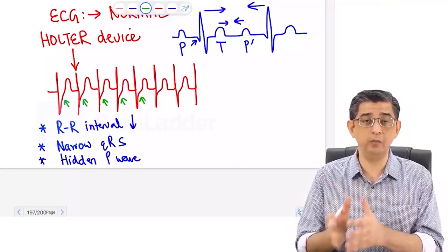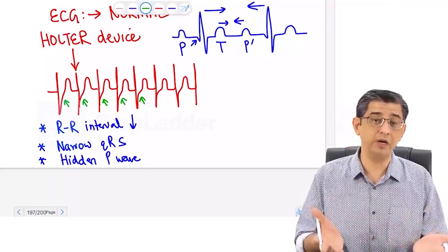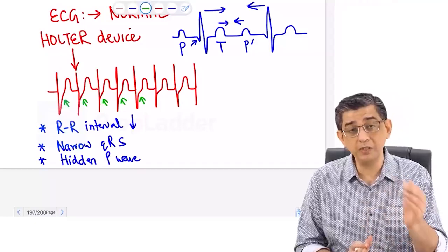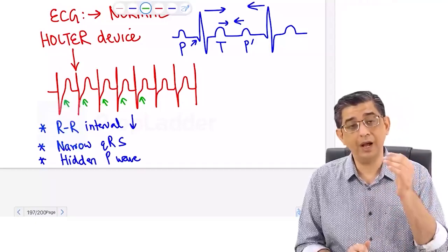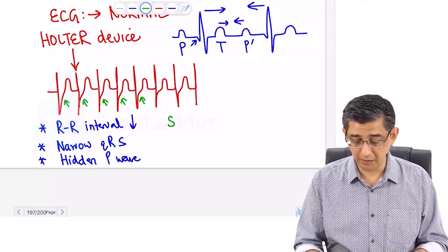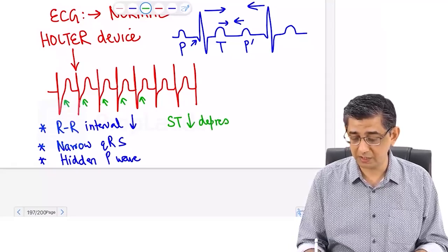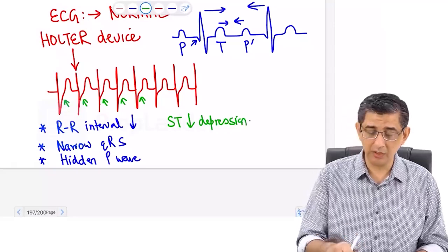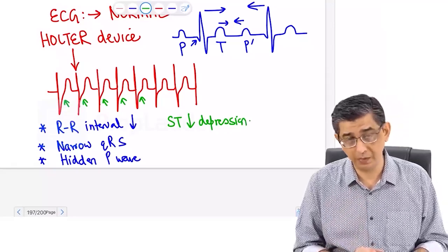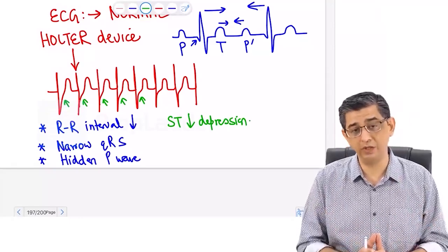I mean, there's a limited amount of oxygen available via the patent coronary arteries of the patient, and the demand is tremendously more. So because of the mismatch between the demand and the supply, there can definitely be some magnitude of ST segment depression present in a lot of ECGs of PSVT, AVRT. The green is representing the global ST segment depression. What I mean by global is it would be present all over, that is, all the 12 leads of the ECG.